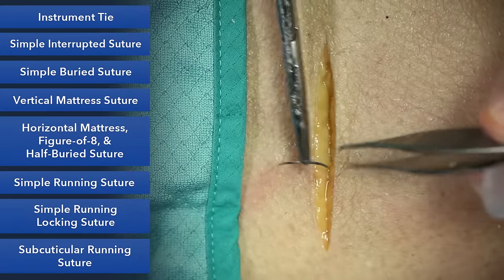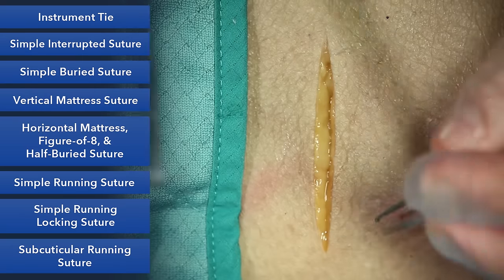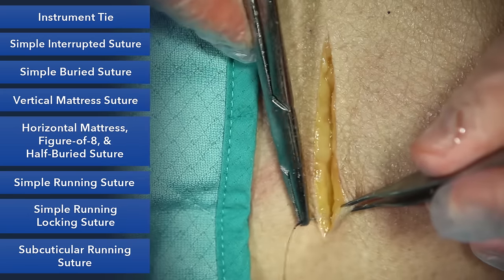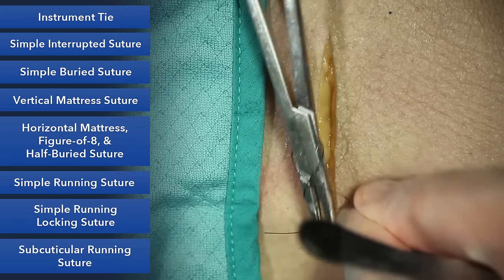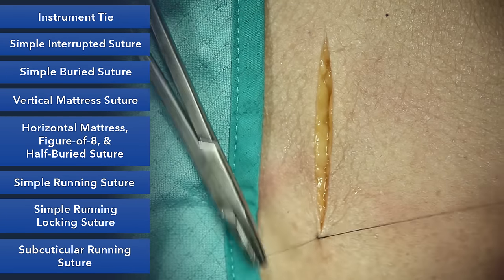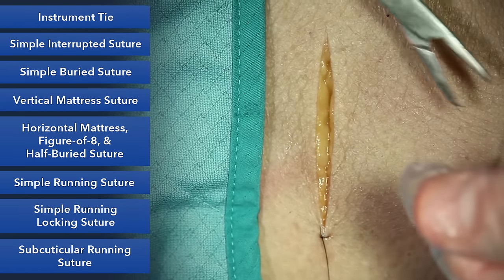Our next stitch is a simple running suture. This will be the most common suture you'll use to close incisions. It's a simple suture, so again, 90 degrees and 90 degrees, same bites on both sides. And you'll start with an instrument tie and try to save length on your suture here. You also want to measure the length of your wound and make sure you're not working with such a long suture that it becomes unruly.